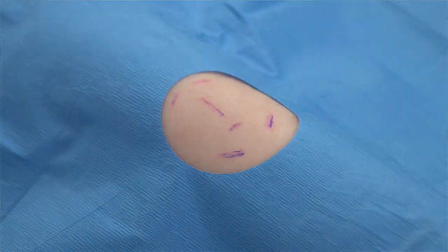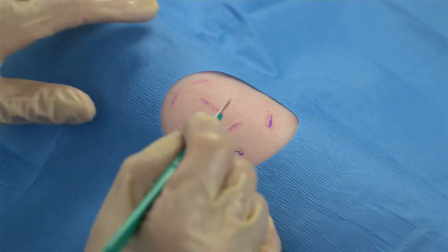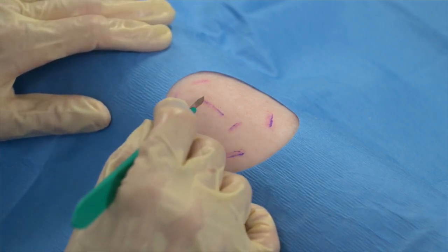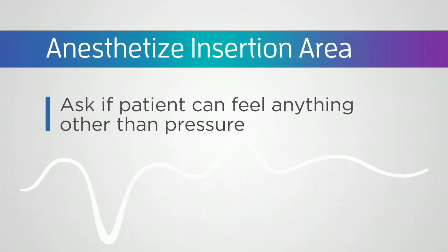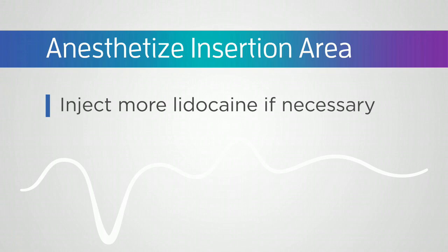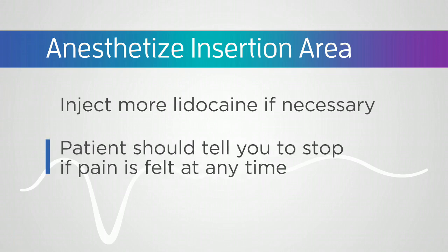Now you need to make certain the insertion area is fully anesthetized, which typically takes 1 to 2 minutes. With the tip of the scalpel, tap several points of the planned incision line and vertical sensor pocket path. Ask your patient if he or she can feel anything other than pressure. If yes, wait another minute or 2 prior to checking again. Inject more lidocaine at this point if necessary, while still maintaining sterile technique. Explain to your patient to tell you to stop if pain is felt at any time.